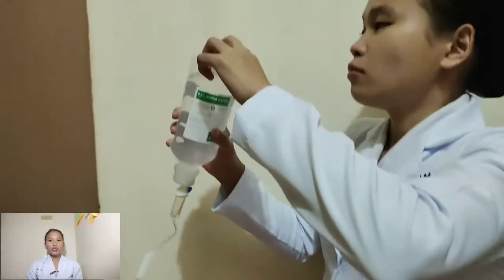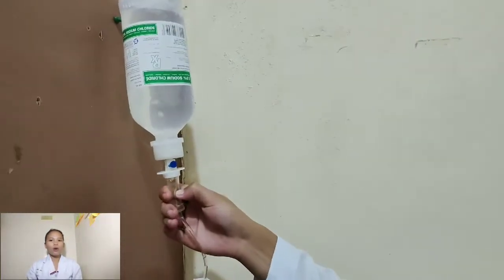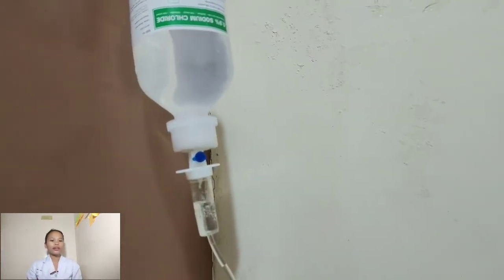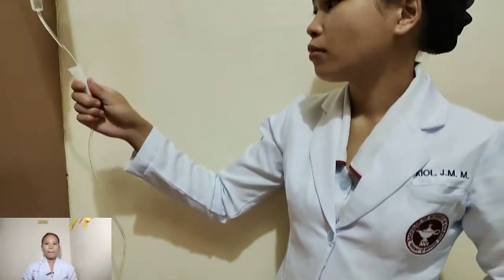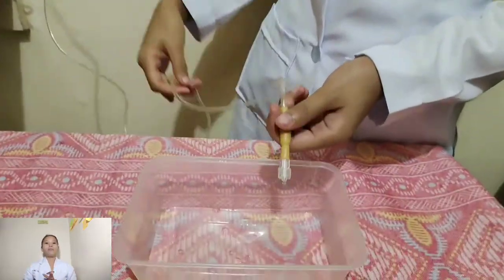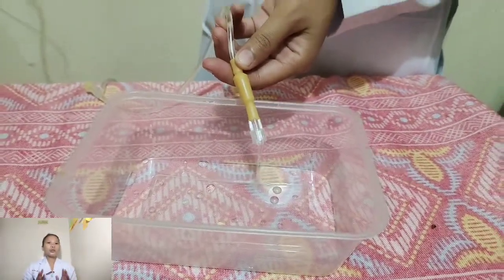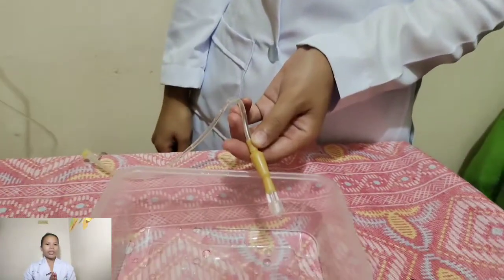Next, suspend the IV solution on a hook in the preparation area and press the drip chamber and allow it to fill at least halfway. Suction effect causes fluid to move into the drip chamber and also prevents air from moving down the tubing. Remove the cap at the end of tubing, release the clamp and allow the fluid to move through the tubing. Allow fluid to flow until the air bubbles have disappeared. Close the clamp and recap the end of the tubing, maintaining sterility of the setup. This removes air from the tubing, which in large amounts can act as an air embolus.